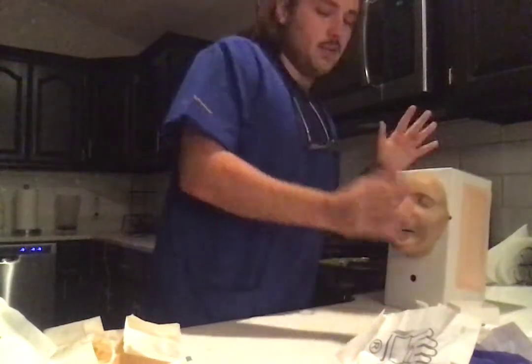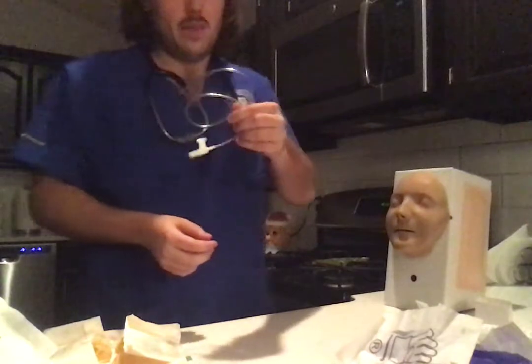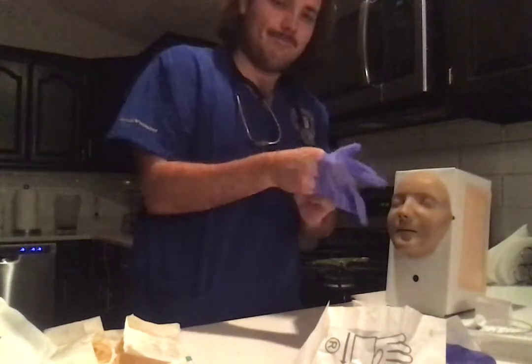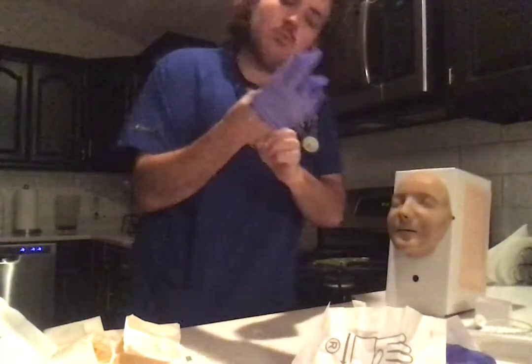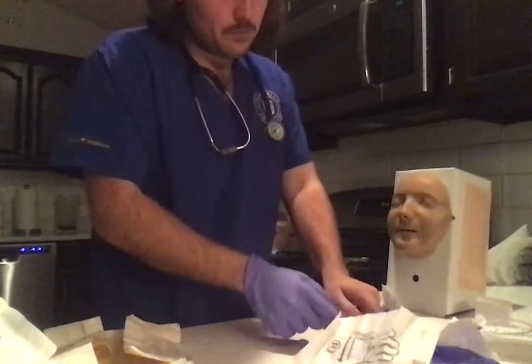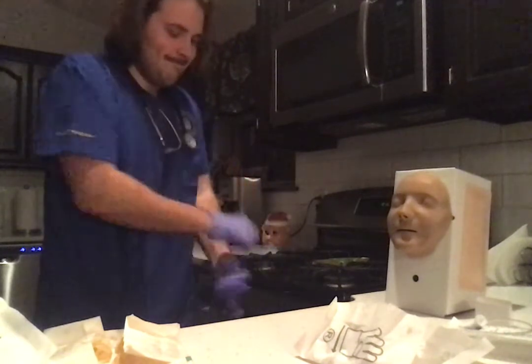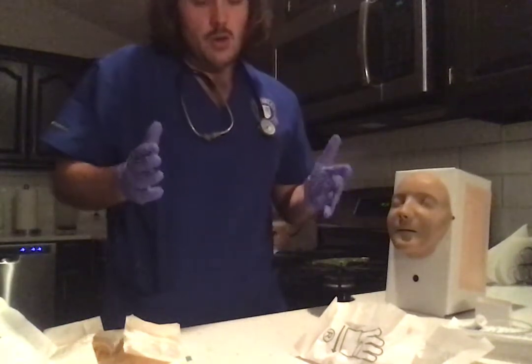So for the suctioning, mine's already out, I apologize. We'll be using this cup for sterile saline, and also be preparing our catheter itself. Once all of our supplies are ready, you may don your sterile gloves. The hardest part of every skills check. Once our gloves are on, we would then be able to move forward.